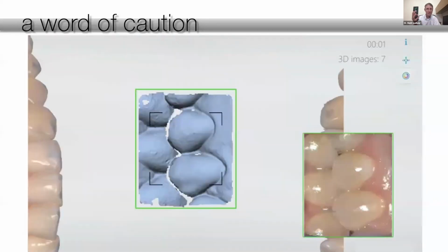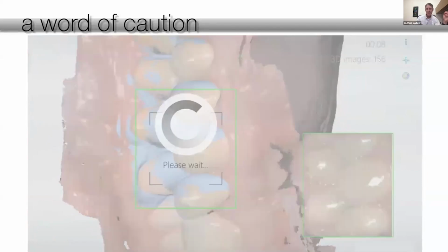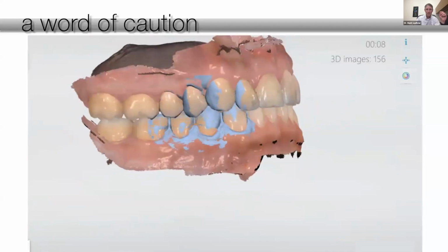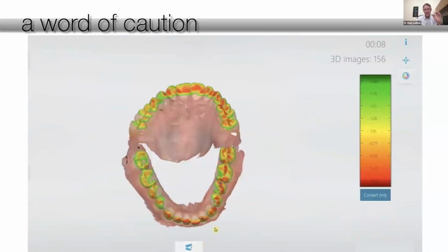Every so often, you just get that. And you saw it only was closed on the one side, so you go to the other side and take a secondary bite. And now watch what it does here too, okay? It ever so slightly cocks it and moves it. Now, this doesn't happen across the board on scanners, but this sometimes can happen on some scanners.